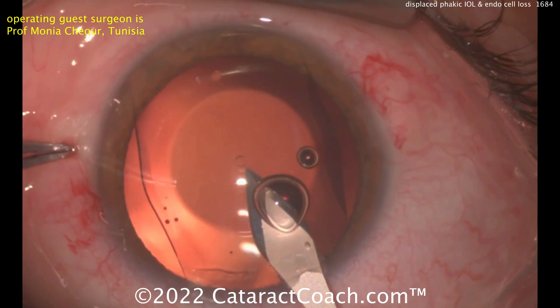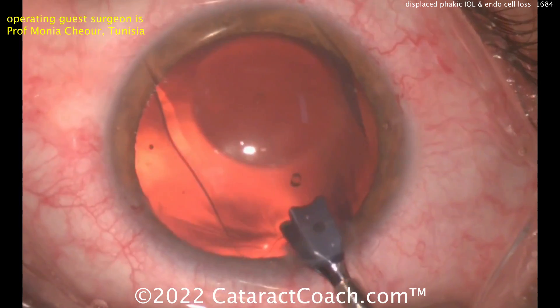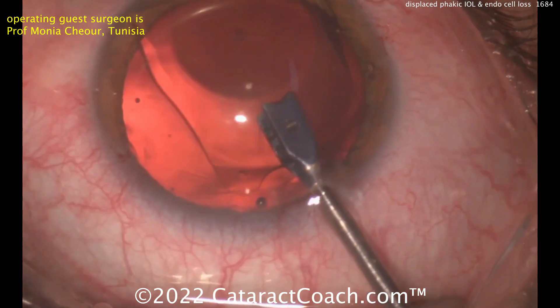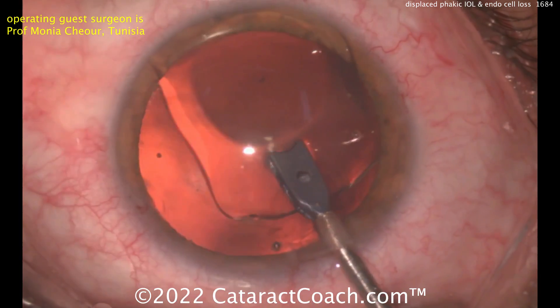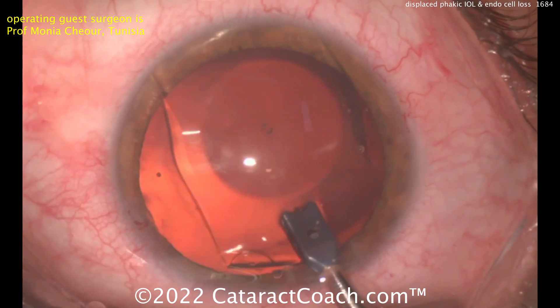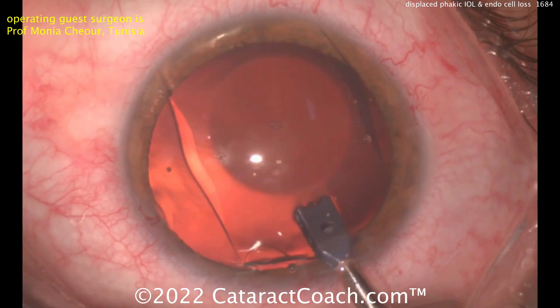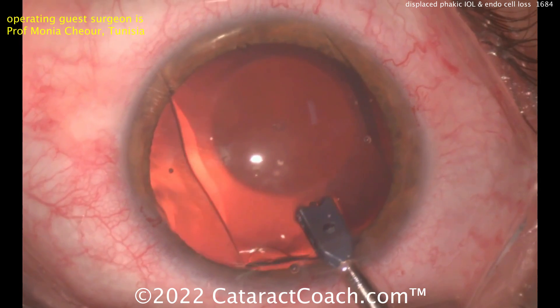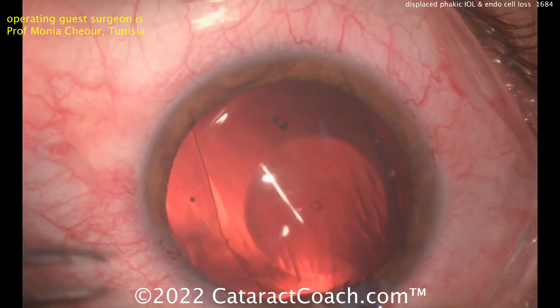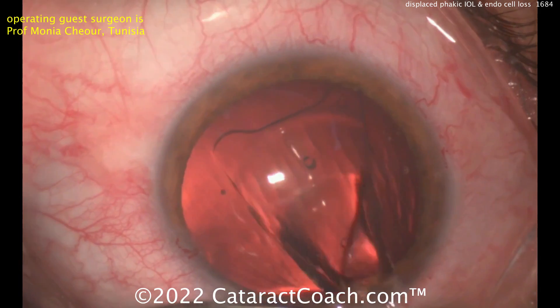But sometimes in a case like this, you see that lens is really causing some endothelial cell loss. Now using these special forceps, that lens is thin enough that you can just grab it and it'll fold on itself, and you can pull it right outside the eye. These are very, very thin phakic IOLs — so pull that right out of the eye, and there it goes.